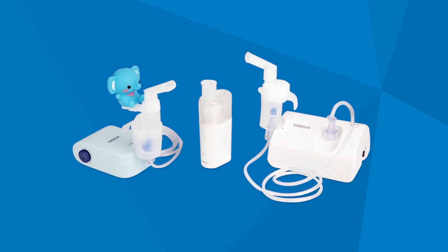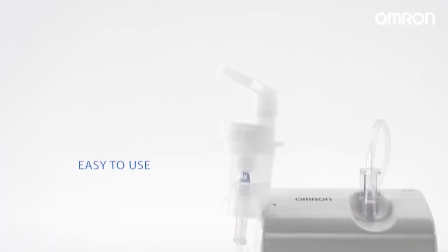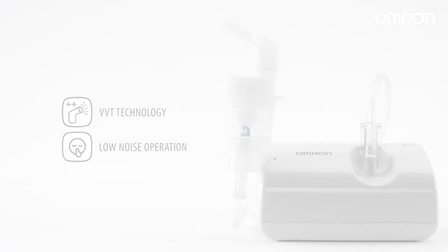Omron offers a versatile series of nebulizers to treat a wide range of respiratory diseases. The CompAir C801 is a lightweight, easy-to-use compressor nebulizer that features Omron virtual valve technology and built-in low-noise operation for quiet treatments.